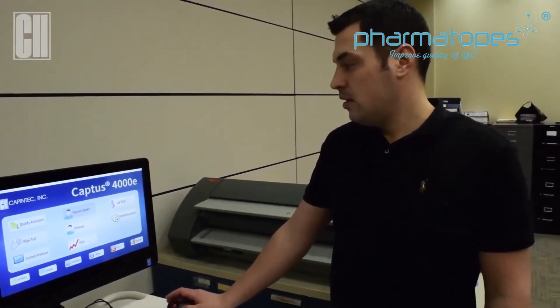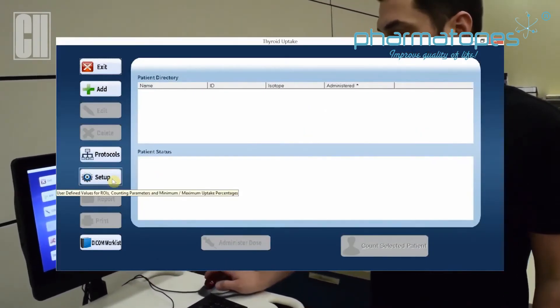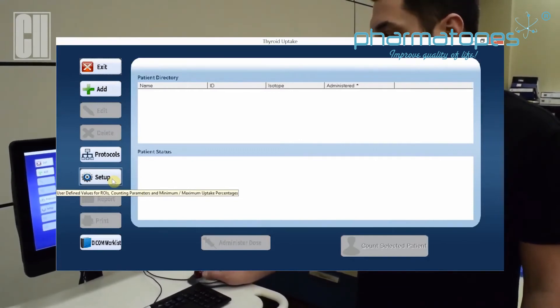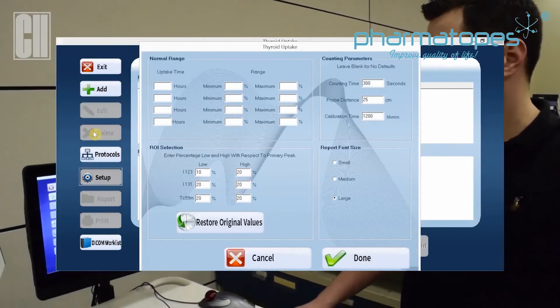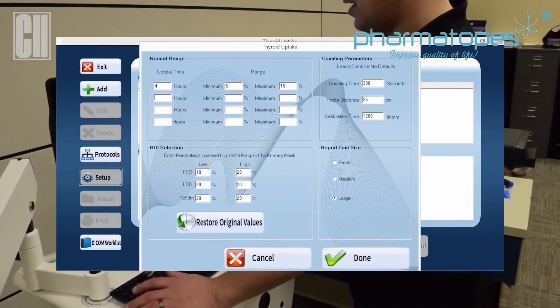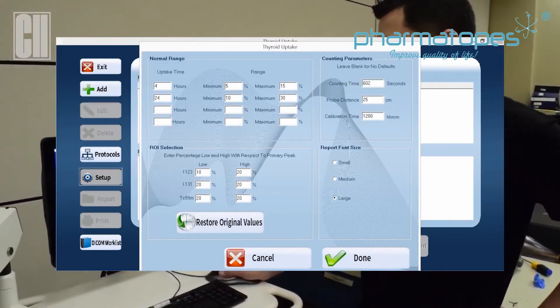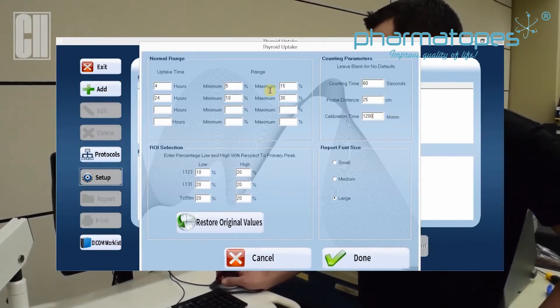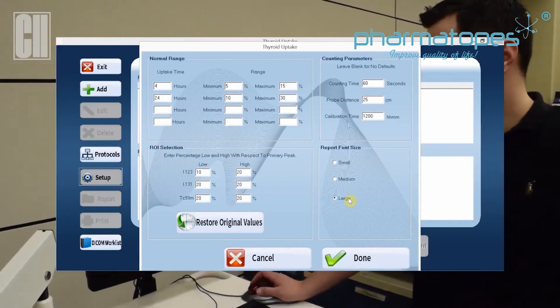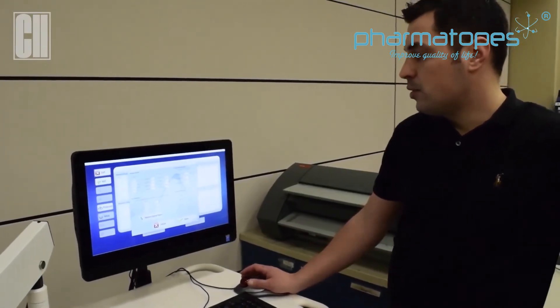For your thyroid uptake to be ready to perform studies with patients, in the thyroid uptake screen we've already added a protocol from the initial setup. We're now going to do a general setup for the study. Here is where we enter the normal ranges for your typical uptakes — for example, a four-hour uptake might see 5 to 15 percent, and for a 24-hour, we might see 10 to 30 percent. Counting time can be set by the facility — in this case, 60 seconds at 25 centimeters. Calibration time of 12 o'clock is in reference to the capsules. For the report font size: if you're only doing one uptake, we recommend a large font; with two uptakes, we recommend the medium font, in order to fit two uptakes on one page.